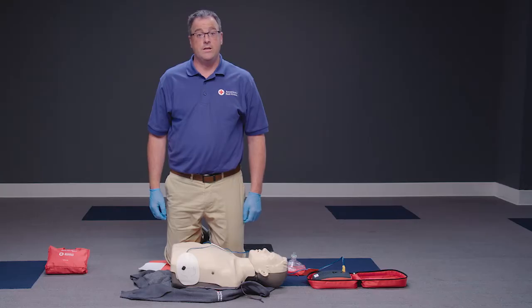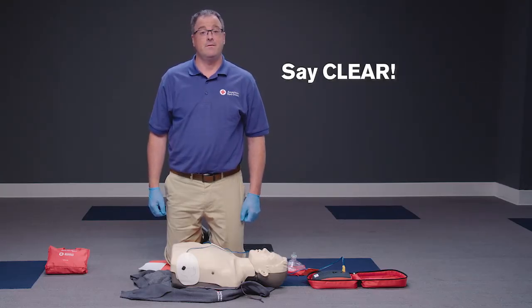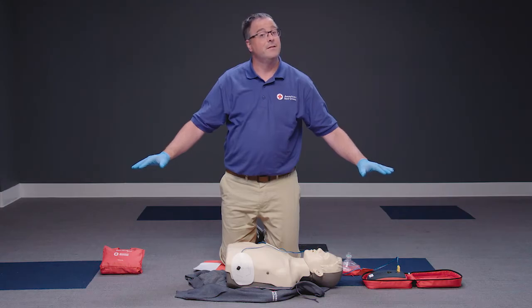Make sure no one, including you, is touching the person. Say "clear" in a loud, commanding voice. Be ready to deliver a shock if the AED determines one is needed.